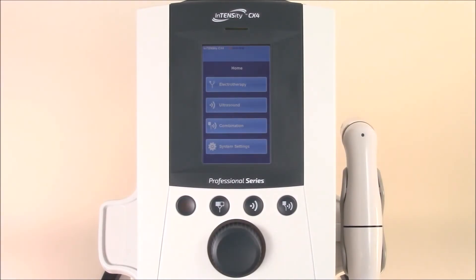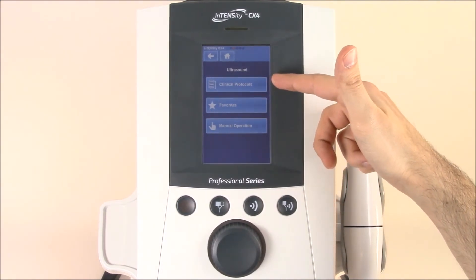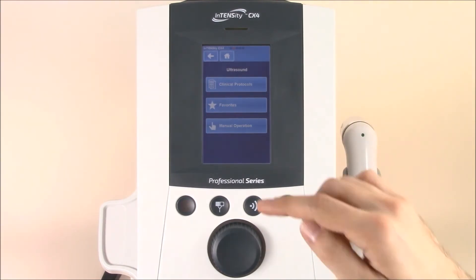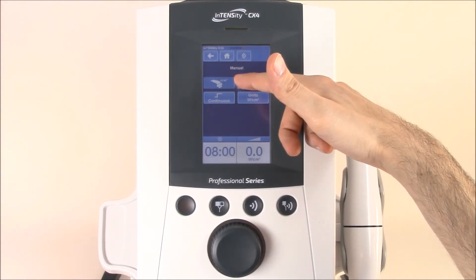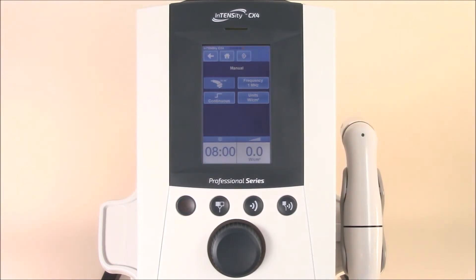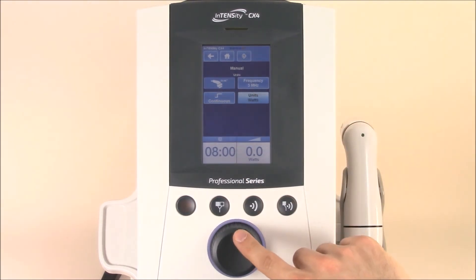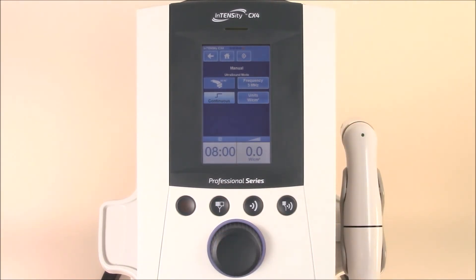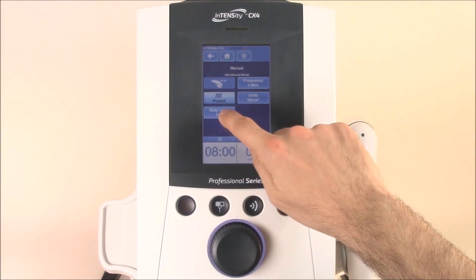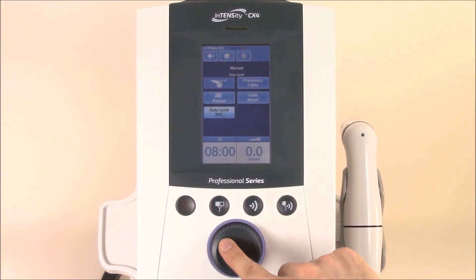Now that you've worked with the electrotherapy settings, let's jump into ultrasound. Simply hit the ultrasound icon and you'll see the same familiar setting options from manual operation to favorites to clinical protocols. Under manual operation, you'll find all of your traditional settings. Here you can see the icon showing we're using a 5 cm ultrasound applicator; if you change to a 1 cm applicator, the icon would change and recognize the new application. You can also select the frequency and adjust from 1 to 3 MHz, choose to work in watts per centimeter squared or just watts, and change your setting from continuous to pulsed. The pulsed feature has a duty cycle option from 10 to 90%. You can also adjust your timer here and select the power to get started.